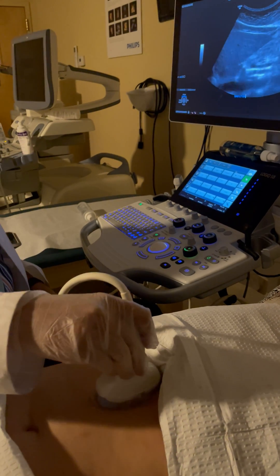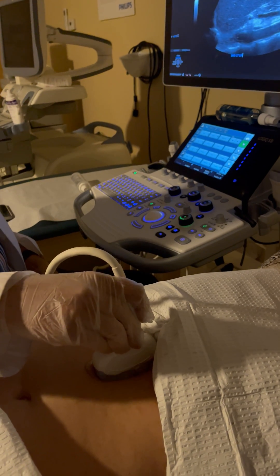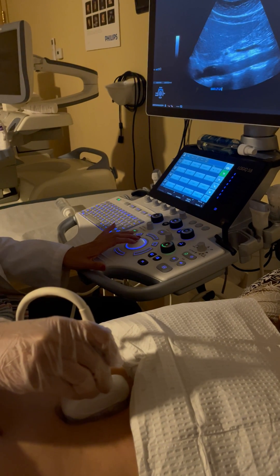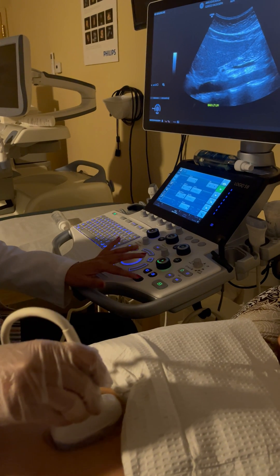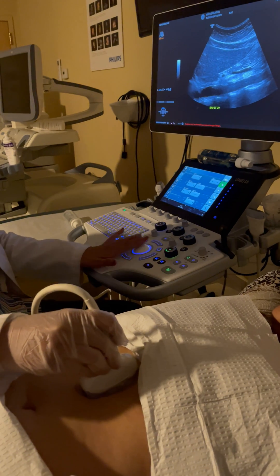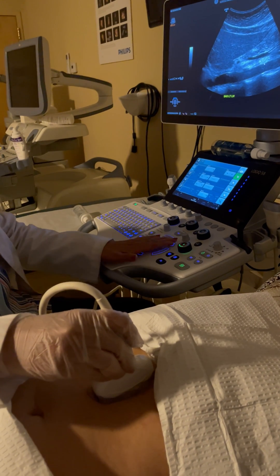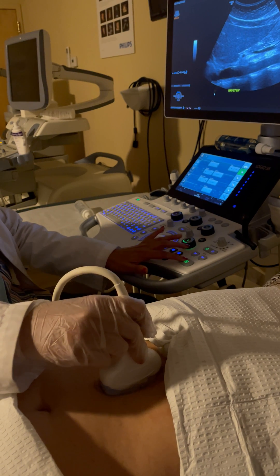I'm keeping my transducer in true sagittal, touching the xiphoid process. I ask the patient to take a deep breath in and hold. The first image is the left lobe inferior margin with the aorta. You can see the left lobe inferior margin completely open from tip to tip — this tip is important to include so you don't miss any masses, and the aorta should be fully open. This is the first image of the sag left lobe inferior margin including the aorta.